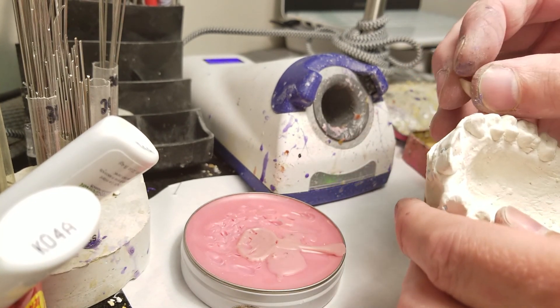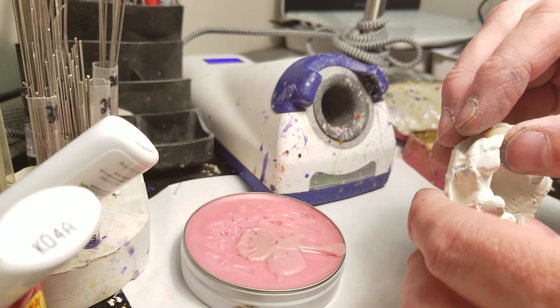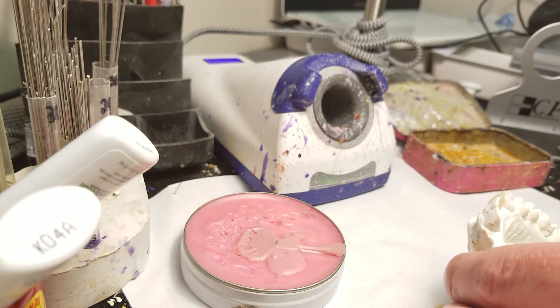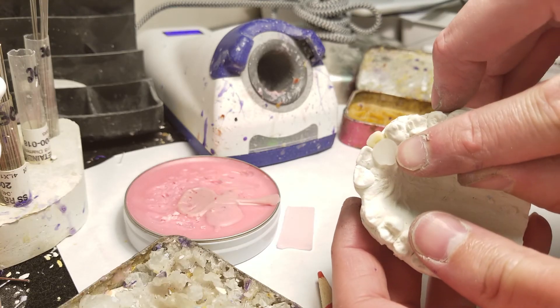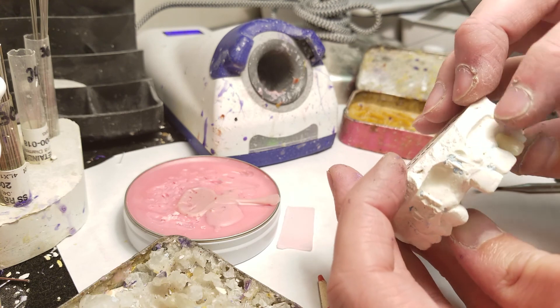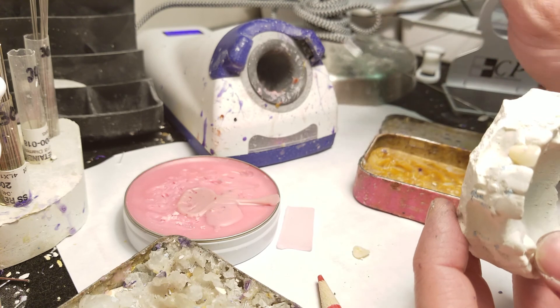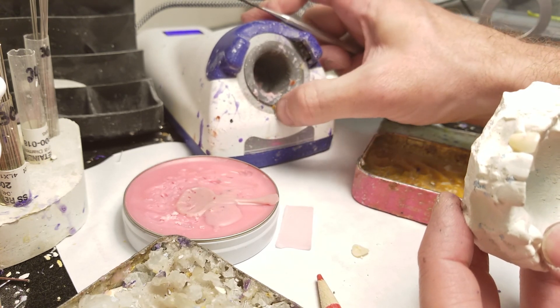Let me show you a quick demonstration of how this works. I have some pontics here that I need to wax into place — I've already ground them to shape. Now I just need to put my wax on. There's a little utility wax there to hold this into place.